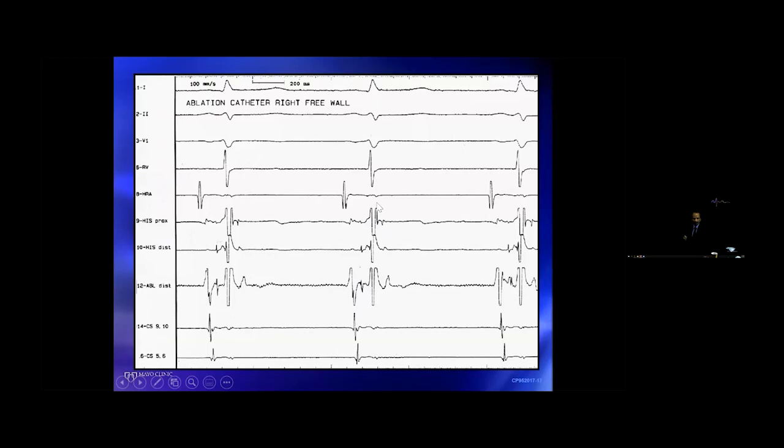Now, the ventricular electrograms are actually late at that site. So mapping the earliest V, like we would for many other pathways, simply won't work because the actual V at the site of successful ablation is going to be late. This is because of this conduction tissue that's ensheathed and taking this pathway signal a long distance down towards the ventricle, close to the right bundle exit where you had anticipated.